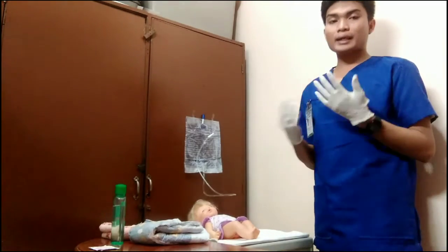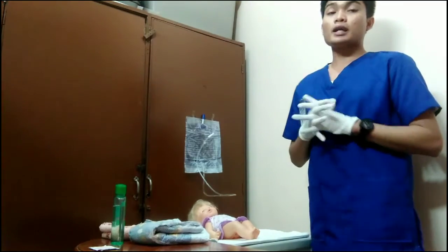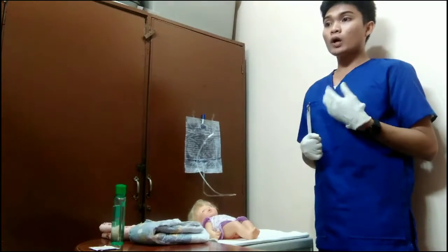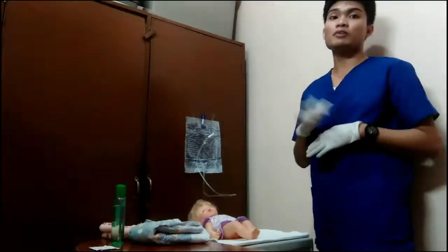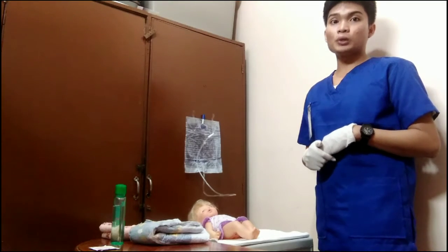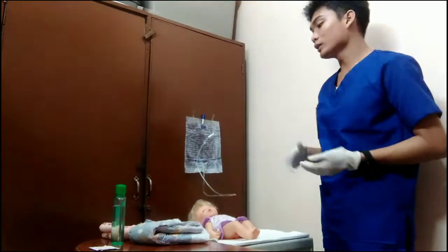And then after we apply clean gloves, we will now be providing client privacy by closing the curtains. So now, what we are going to do is assist the client in a left lateral position or Sims position with her knees actively flexed. We are doing this position because it will allow the flow of the solution by gravity into the descending colon and the sigmoid colon.